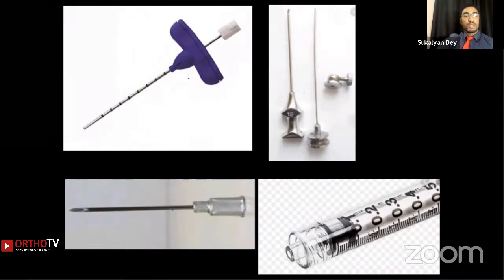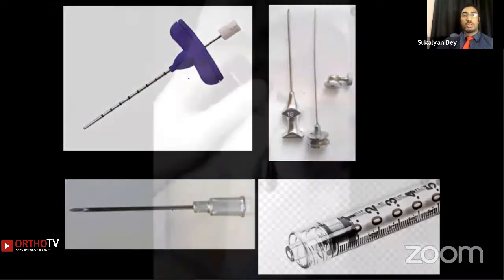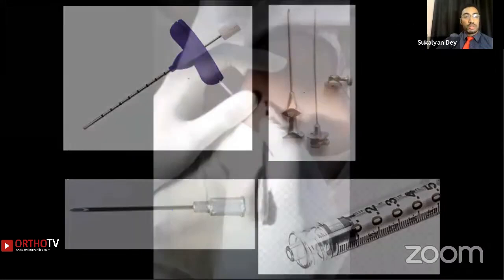Depending on the location and thickness of the cortical wall, we can use either a Jamshidi needle, or we can use a bone marrow aspiration needle, or a simple wide bore IV needle. It is better to have a luer lock syringe having a screw luer lock for a good fixation.